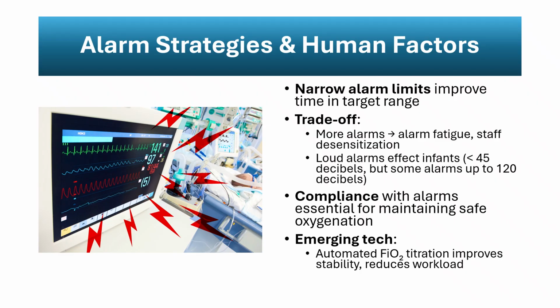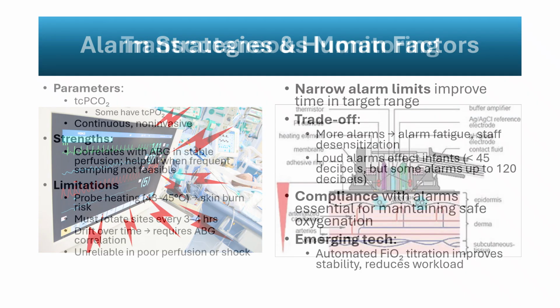Automated systems that titrate inspired oxygen based on continuous saturation feedback are emerging as valuable tools. They can reduce caregiver workload, shorten the duration of off-target saturations, and maintain more stable oxygen delivery when used alongside vigilant clinical oversight.